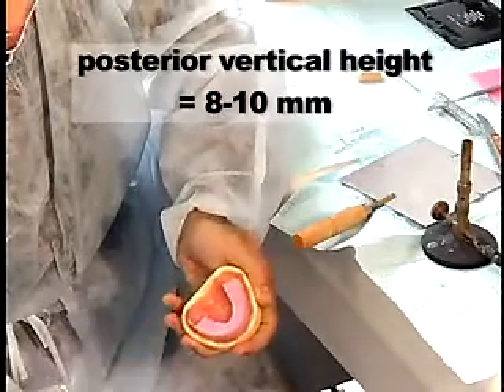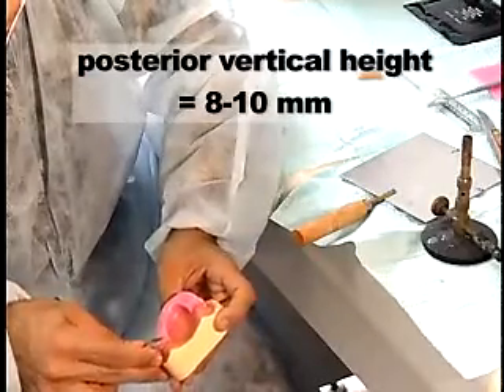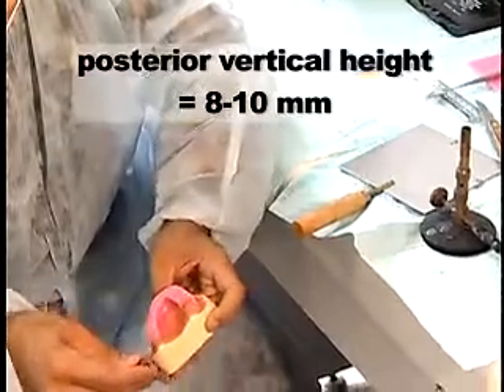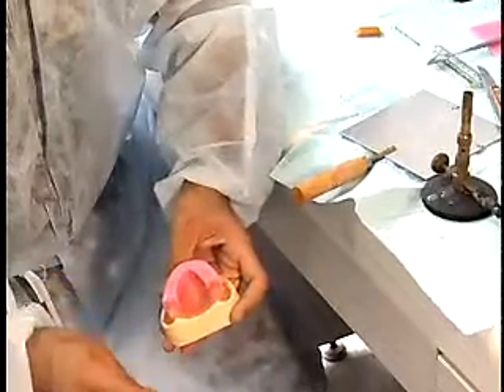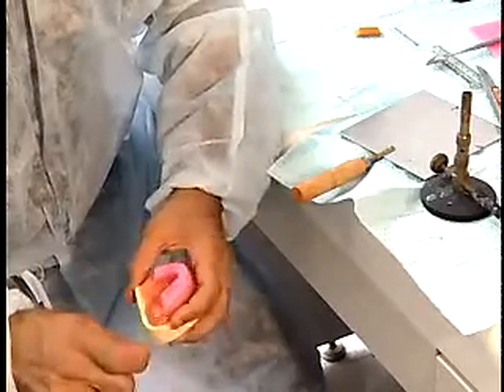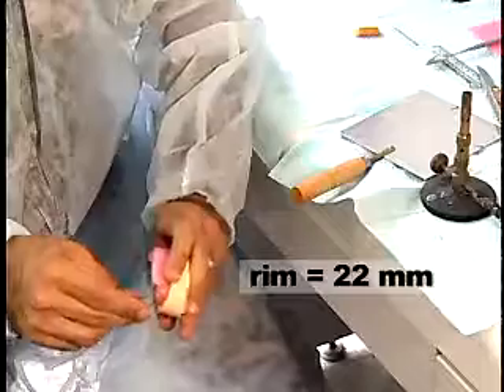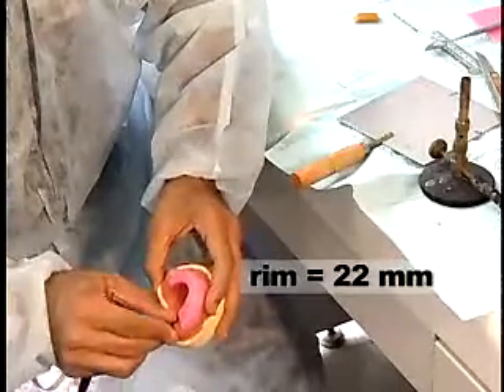The posterior vertical height, measuring from the basal seat surface of the tuberosity to the occlusal plane, is 8 to 10 mm. Anteriorly, the rim is positioned slightly labial to the residual ridge. The rim will measure 22 mm from the anterior labial border to the incisal edge.